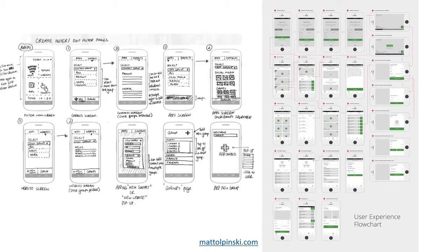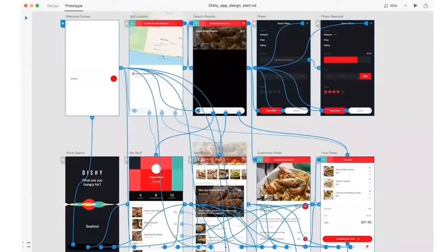And you've got to be very careful sometimes in translating that to graphical user interfaces, because, for instance, the branding colors might be red, black, and gold, and red is used very differently in a graphical user interface. So you have to be careful about how you apply those style manual guidelines. And I imagine red also has a certain meaning in medical devices quite often. Yeah, it means danger or error or an alert, and sometimes you've got to tiptoe around that to find the right balance.